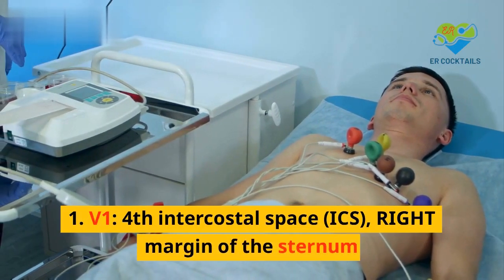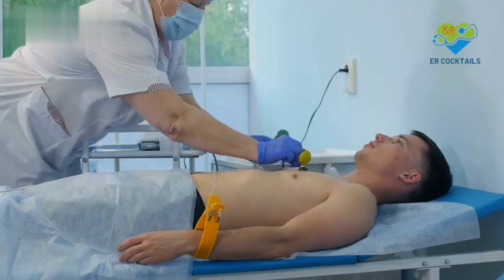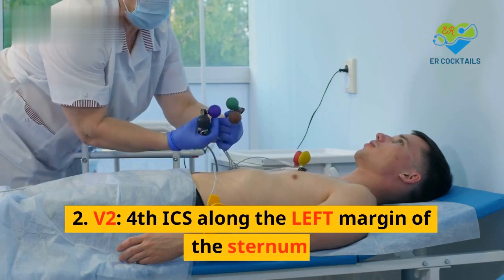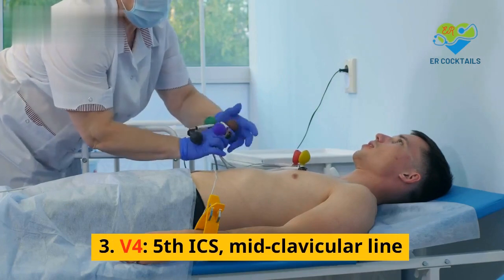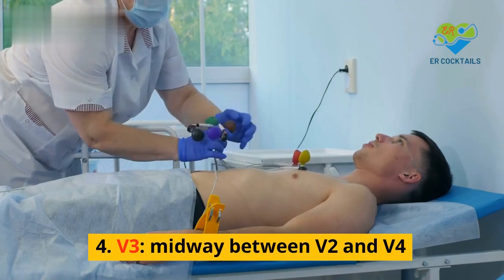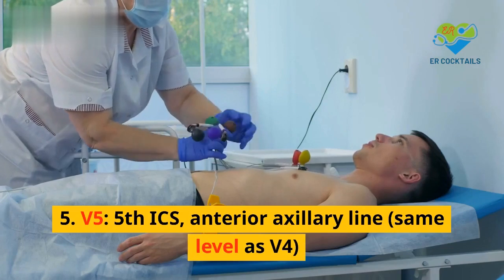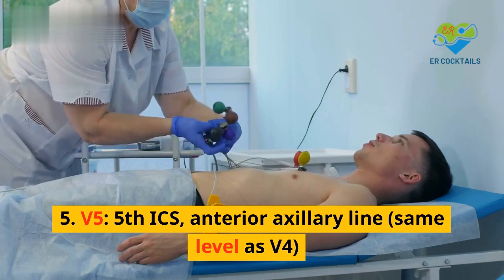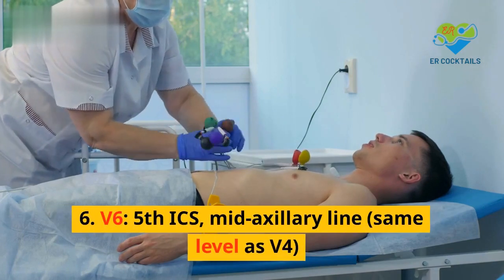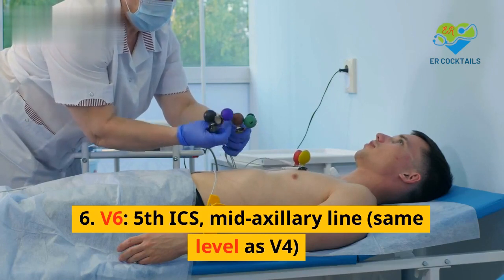12-lead precordial lead placement. 1. V1, 4th intercostal space, ICS, right margin of the sternum. 2. V2, 4th ICS along the left margin of the sternum. 3. V4, 5th ICS, mid-clavicular line. 4. V3, midway between V2 and V4. 5. V5, 5th ICS, anterior axillary line, same level as V4. 6. V6, 5th ICS, mid-axillary line, same level as V4.